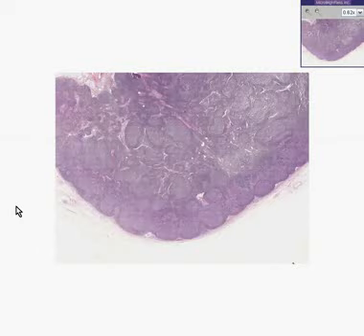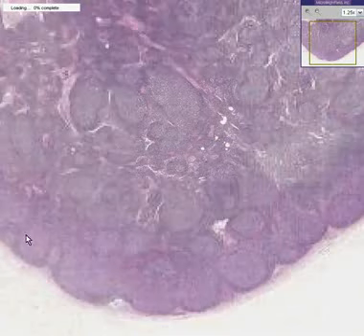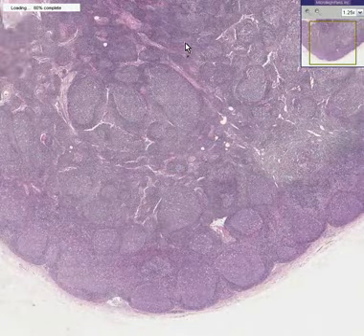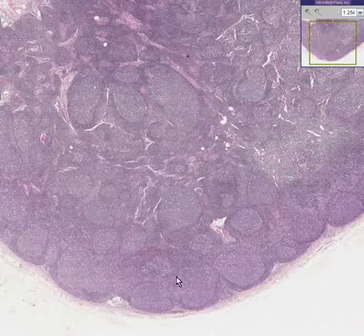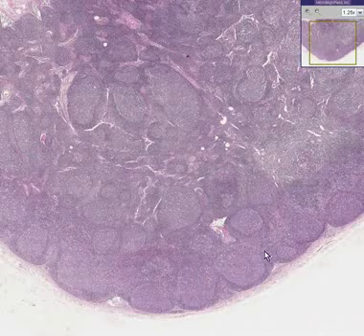Well, in this lymph node, we can see, compared to all the other nice normal textbook lymph nodes that we've seen, that the overall architecture is preserved in that you generally see nice well-formed follicles, and more towards the center you get these straighter linear areas like cords. However, if you have looked even at a few lymph nodes, you cannot deny the fact that these follicles, which would be limited to the cortical area generally, are larger and more numerous than they should be.